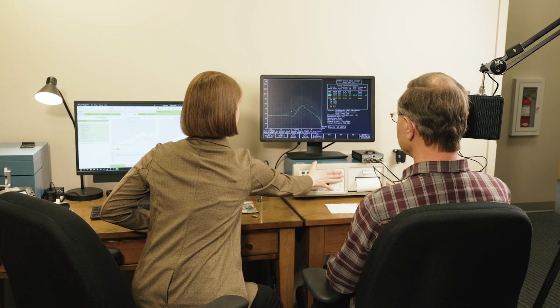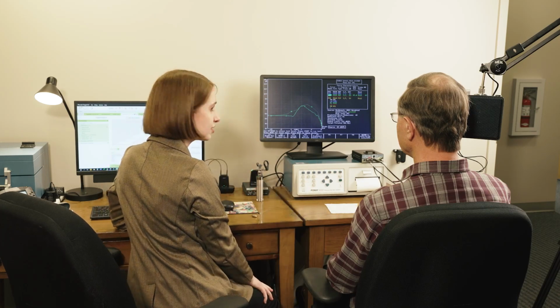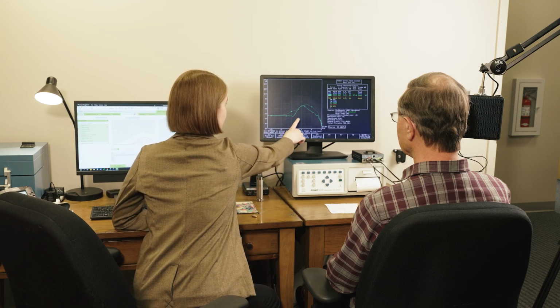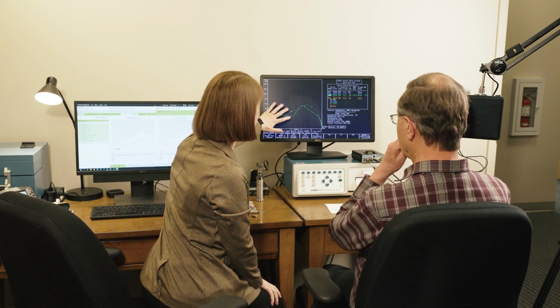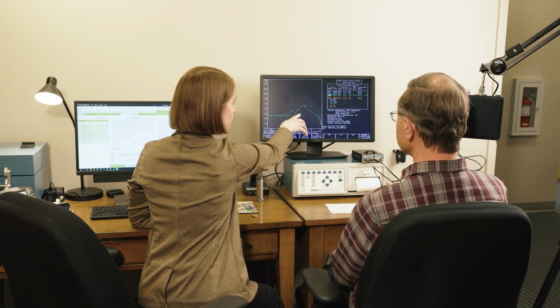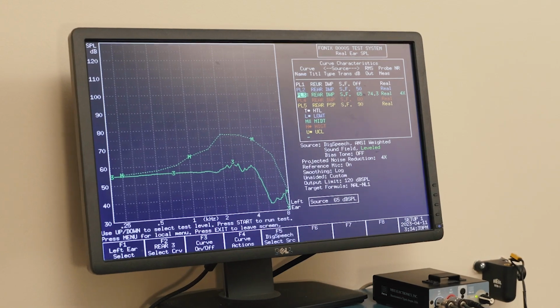We measure each ear separately and begin by turning on the sound of the speaker. A line will appear once we start measuring. This represents what is being delivered to the ear by the hearing aid and is a solid line. The software of each hearing aid manufacturer calculates what is needed to correct the patient's hearing loss. This calculation is based on an algorithm that they have developed.